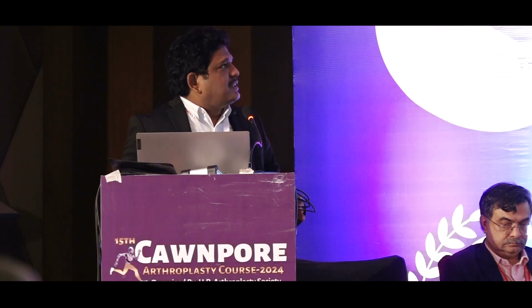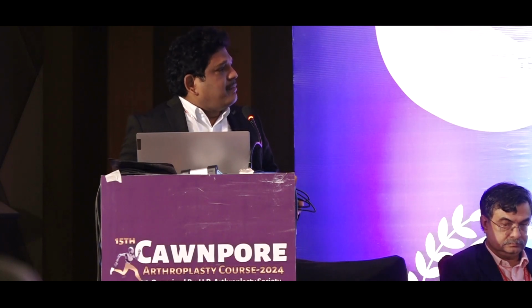One may take a distal cut of the femur first, and once you take a femur cut first, you may be able to flex the knee, and you can proceed accordingly. After flexion of the knee, you can proceed with the standard manner of TKR, because you need to balance the flexion and the extension gap as in a standard manner.